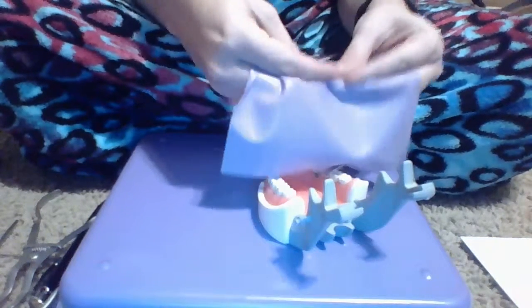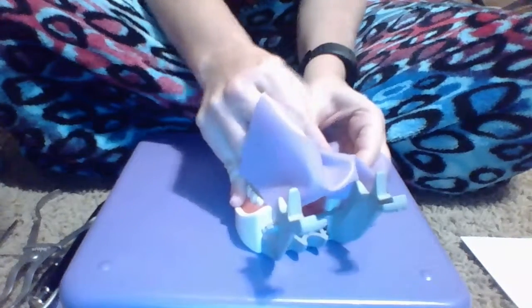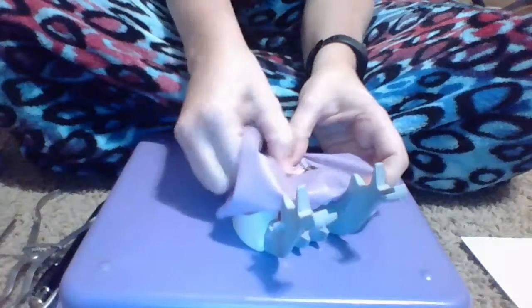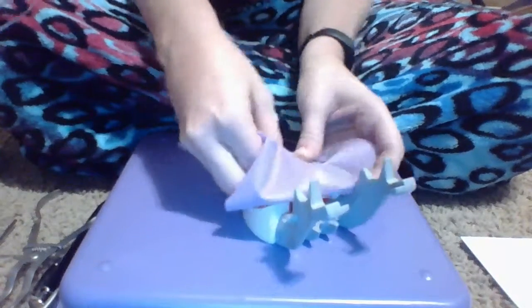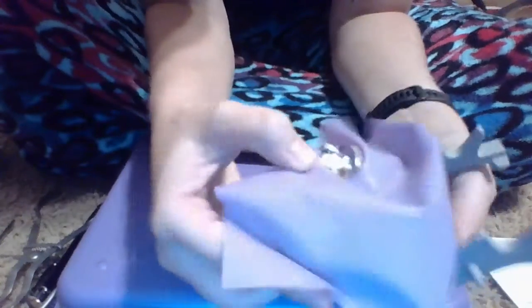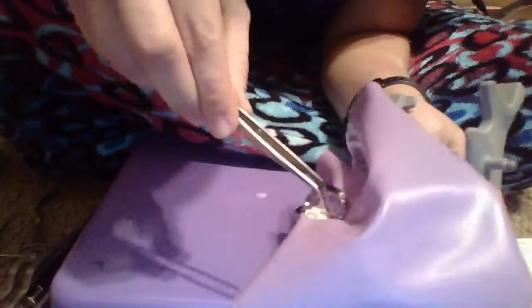Then I'm going to go ahead and place my rubber dam. I will first start by going over the clamp and going over the wings, the back, and the other wing. I know it's really hard to see with this angle but I've got it over the clamp. Now I just need to adjust it using my cotton forceps, adjusting as much as I can and covering up all of the holes so no extra material gets down in there.